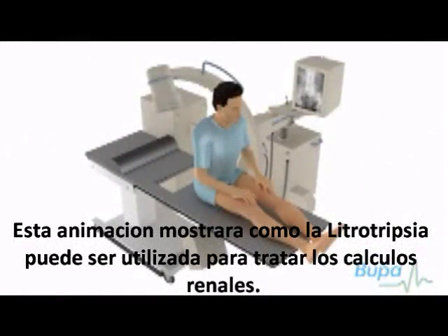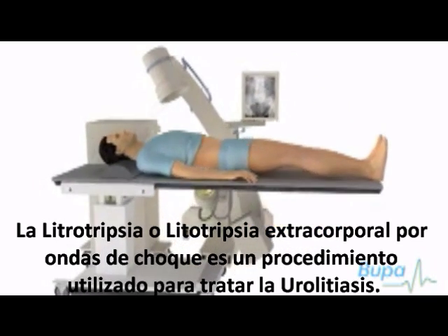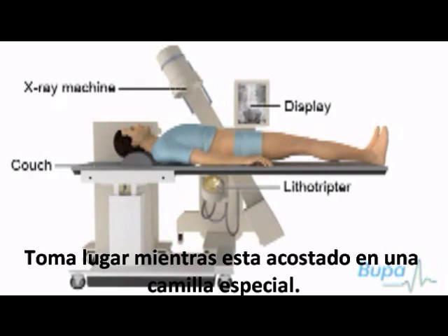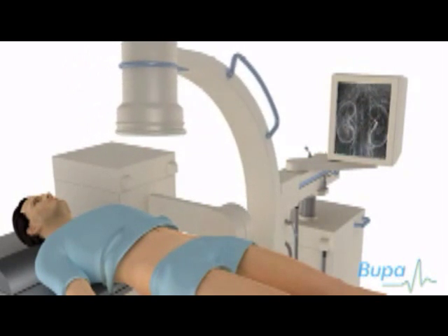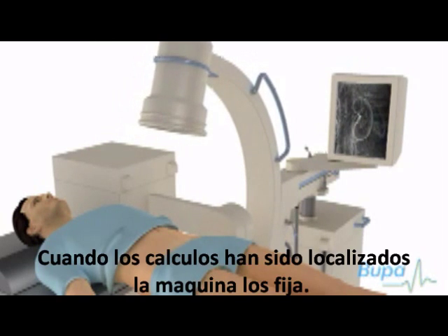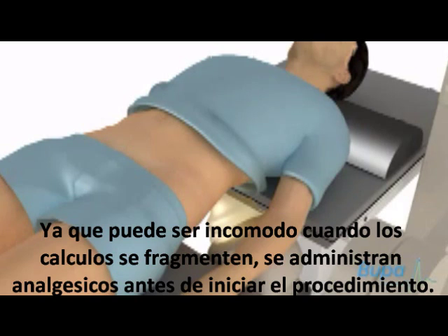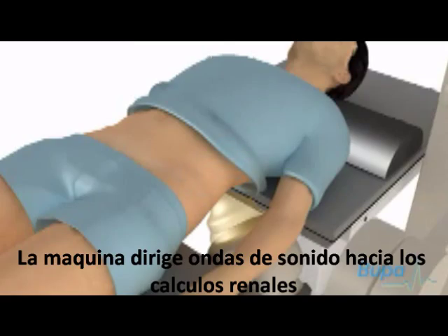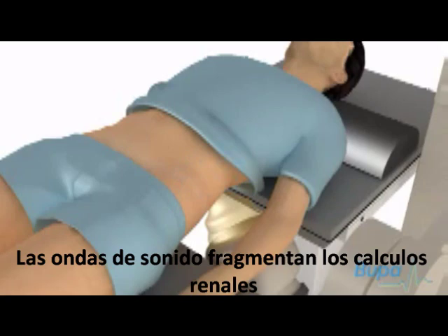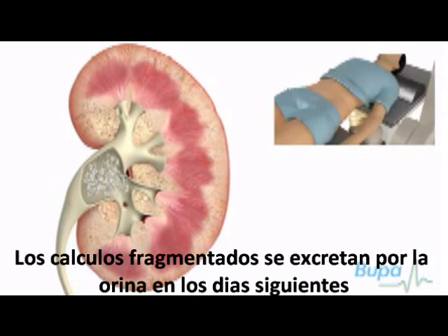This animation will show how lithotripsy can be used to treat kidney stones. Lithotripsy, or extracorporeal shockwave lithotripsy, is a procedure used to treat kidney stones. It takes place while you lie on a special lithotripsy couch. When the stones have been located, the lithotripsy can be trained on them. Because it can be uncomfortable when the kidney stones break up, you'll be given painkillers before the procedure is started. The lithotripsy directs sound waves towards your kidney stones to break them up. The procedure usually lasts about 45 minutes to one hour. The broken up kidney stones are passed in your urine over the next few days.